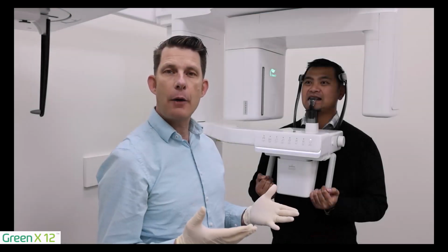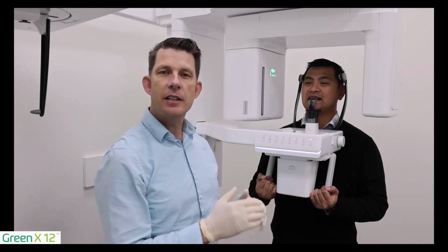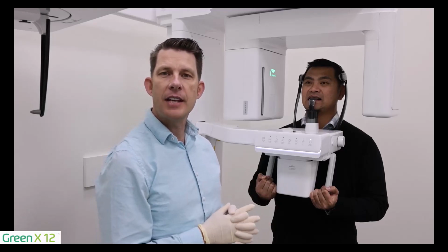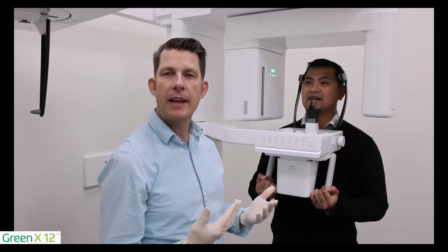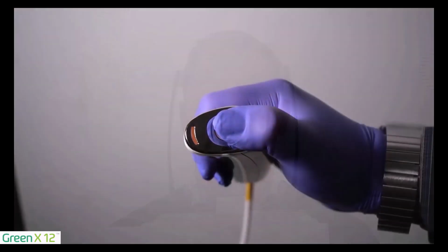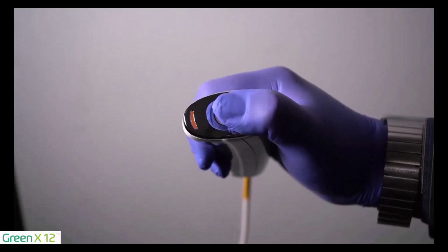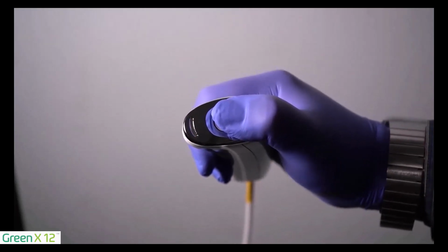We've completed our scout image, and I went over to the acquisition screen and adjusted the field of view as needed. Now we are ready to take the CBCT of the designated tooth. I'm going to go ahead and step out of the room, and we're going to complete the scan. Hold the button on the acquisition trigger switch, which will turn yellow when exposing. Hold the button until the image acquisition is fully complete.